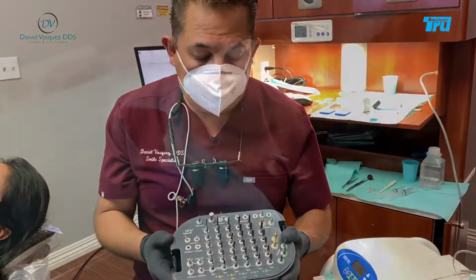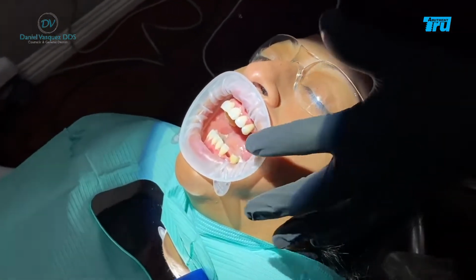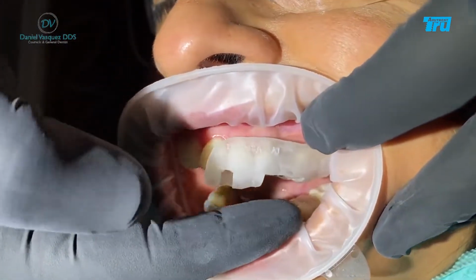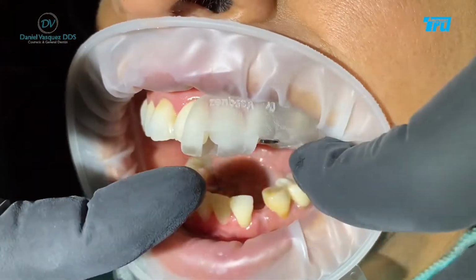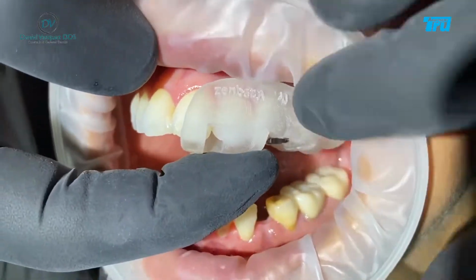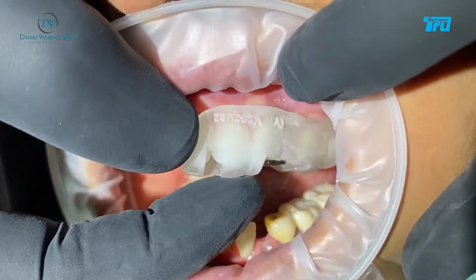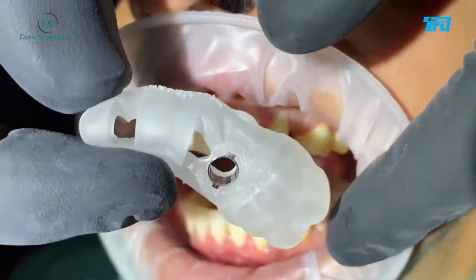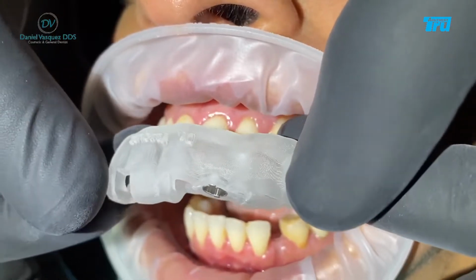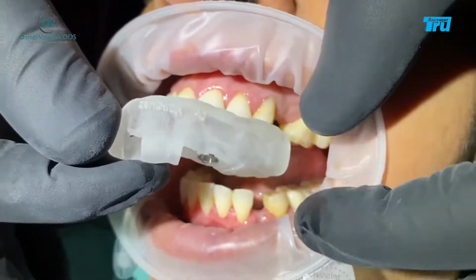and if we follow step by step, I know everything is going to go to perfection. Okay, so now let's try in the surgical guide. It should fit perfectly, passive, with no movement at all. It's nice because it also comes personalized with the doctor's name and the patient's name, so you don't go wrong here.